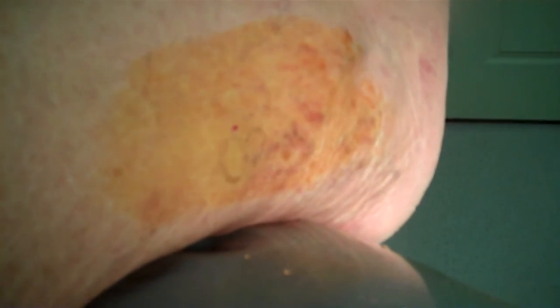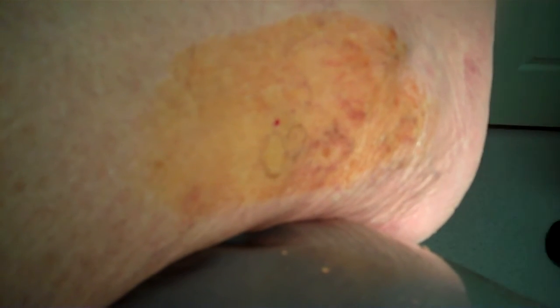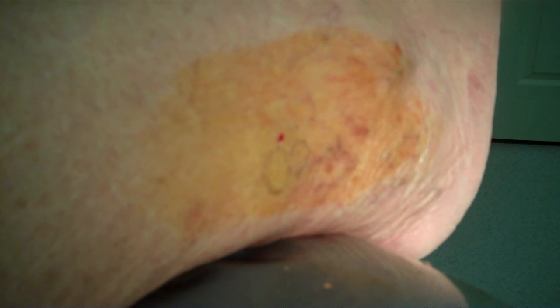Now I'm going to change gloves. Since she's taking the film, I'm going to need you to do that when it's time for the bottle, so she doesn't have to stop. I need another glove.